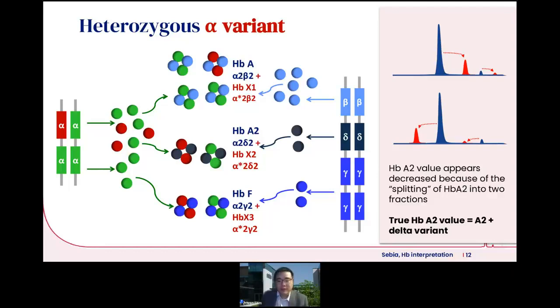So the alpha variant changes would always show you a capillary electrophoretic profile of many peaks. So once again, the exact shifting of the peaks depends on the change that's done to the variant, depending on the chemistry of the resulting hemoglobin, and that would affect where it shifts to. But when you see multiple peaks, it's important to always think of the possibility of an alpha variant happening.